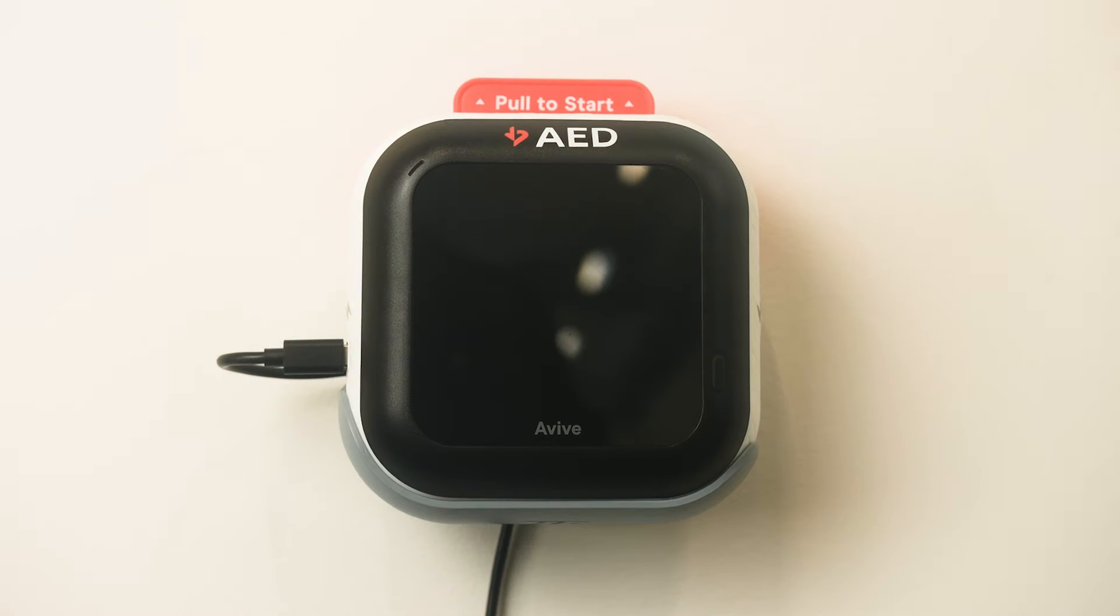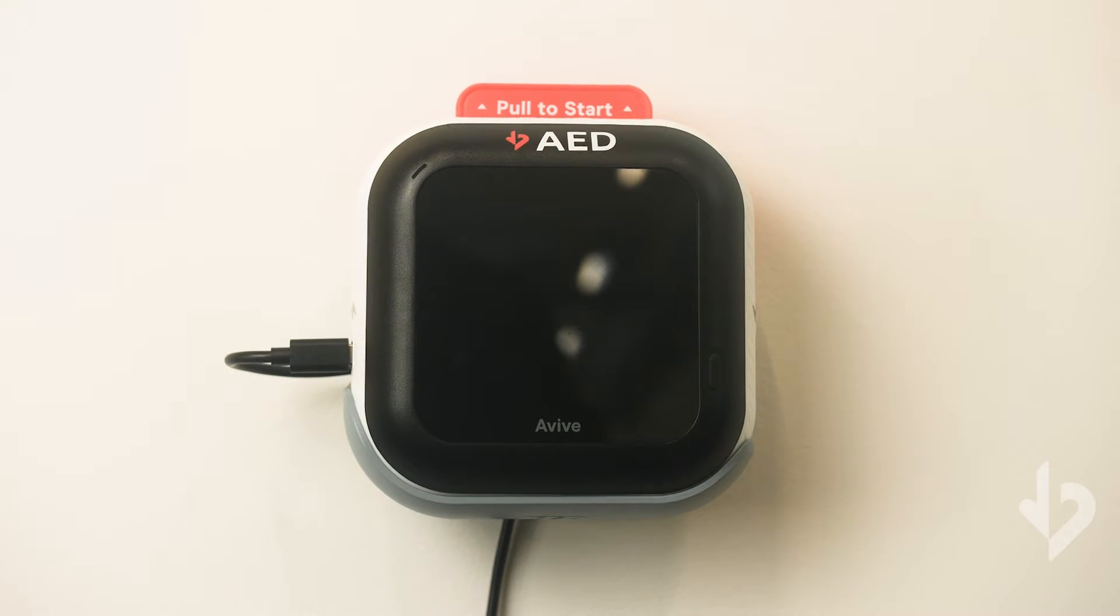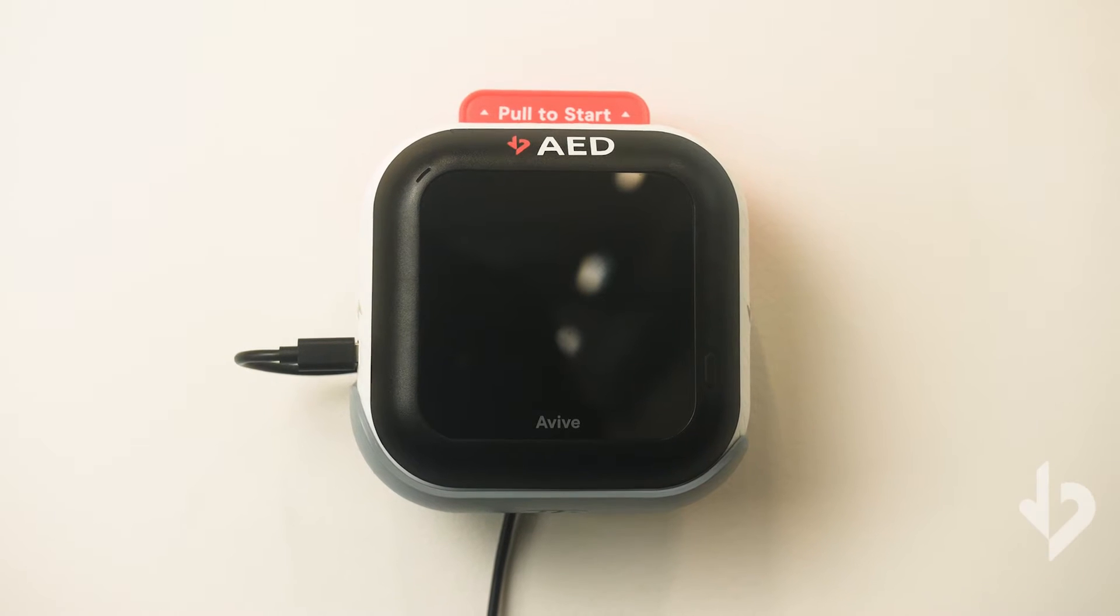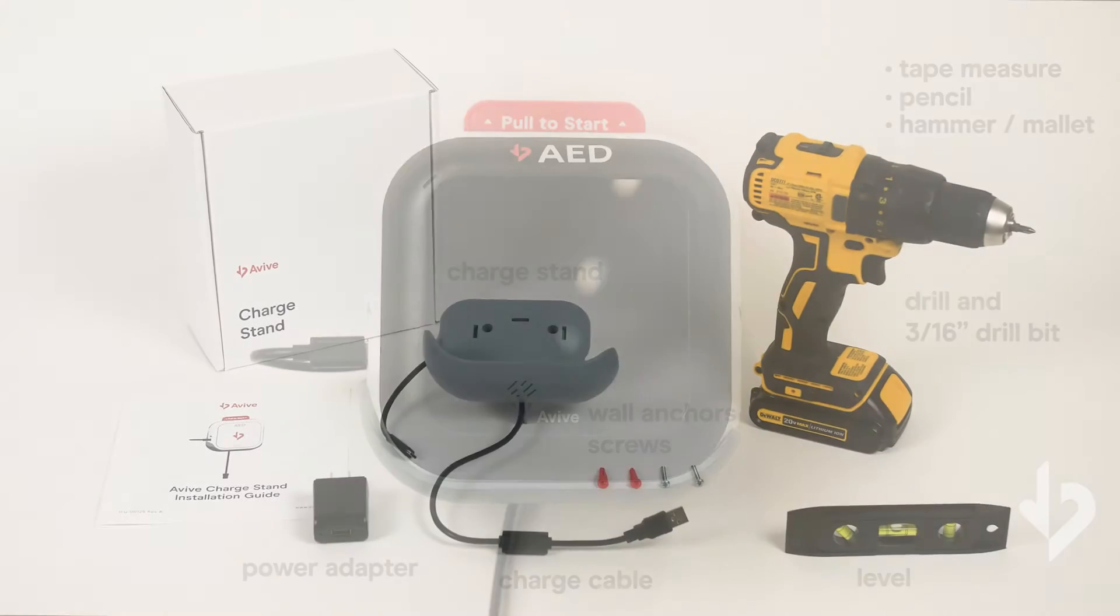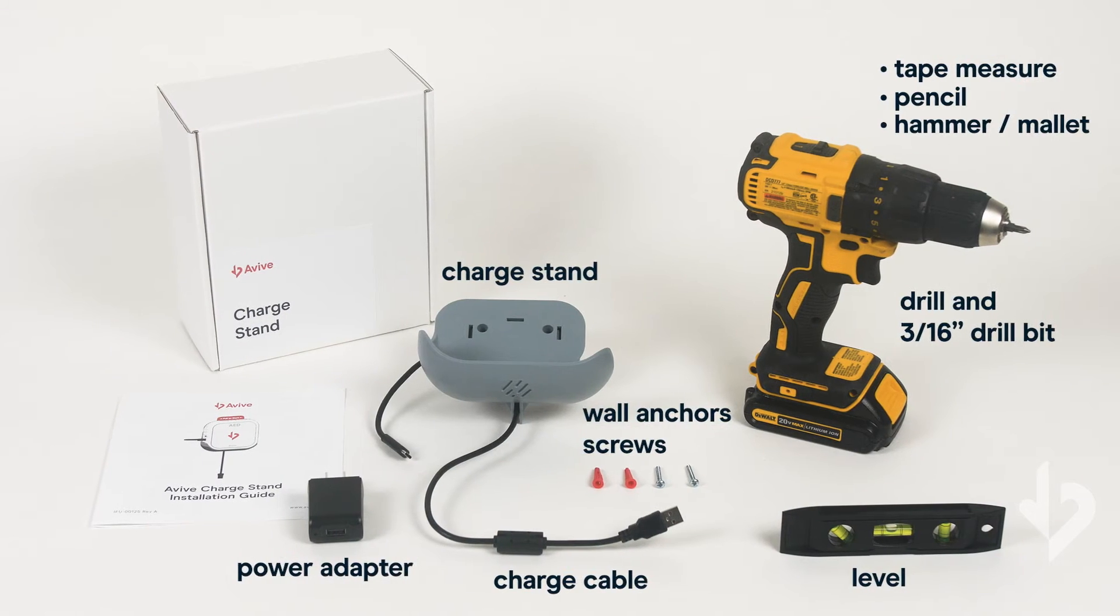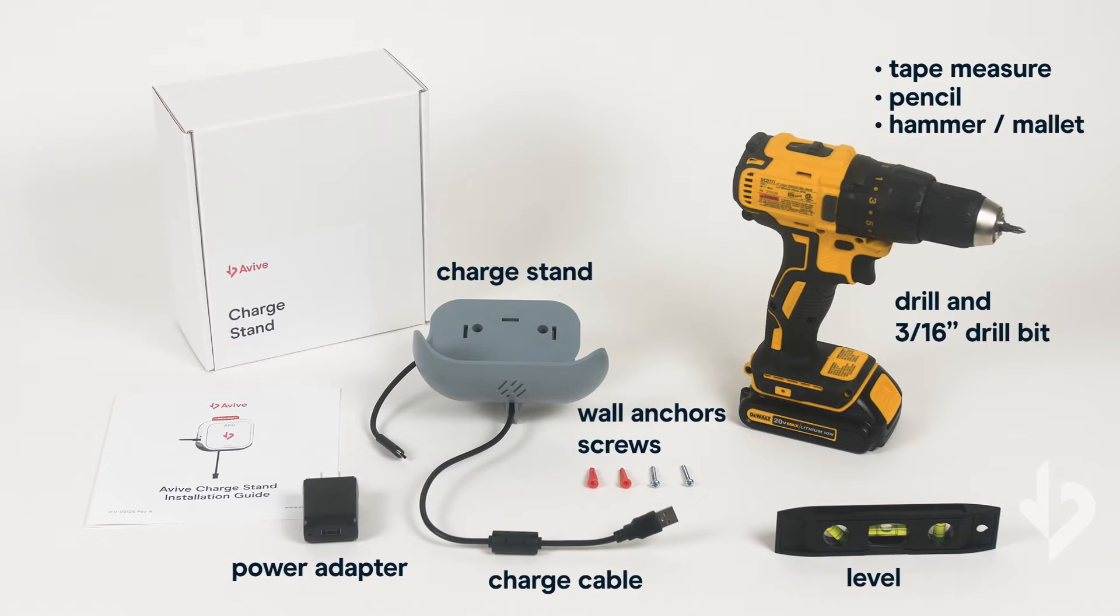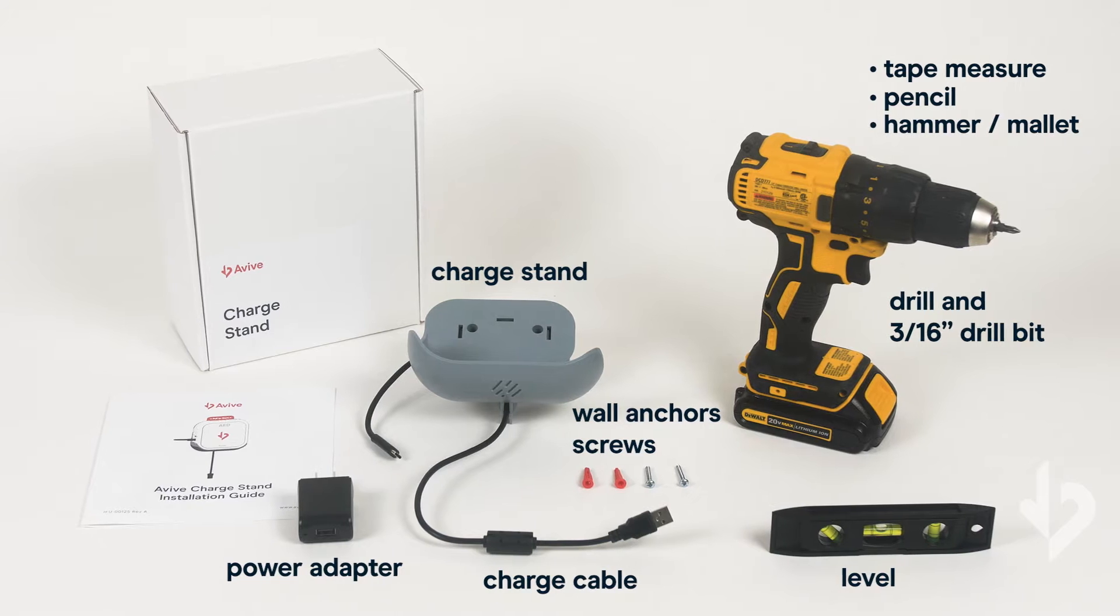This video will help walk you through how to install your AED on the wall. To get started, make sure you have all the hardware from your Vive Connect AED package.